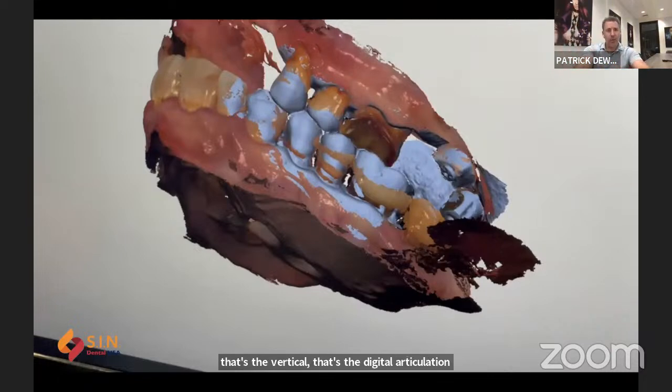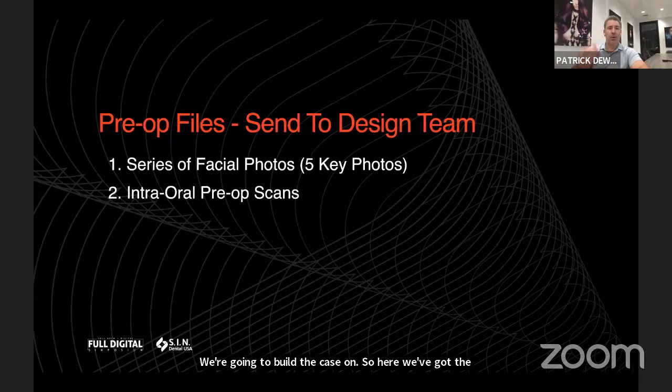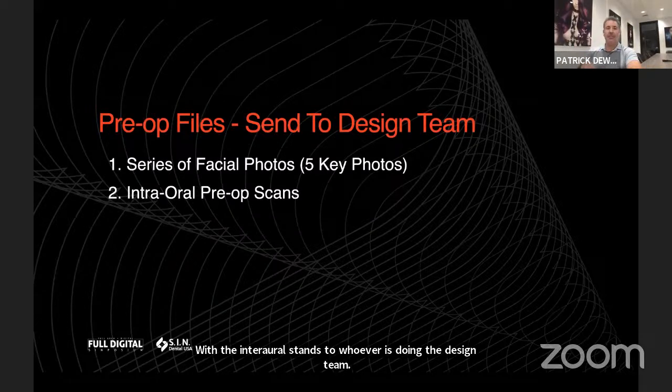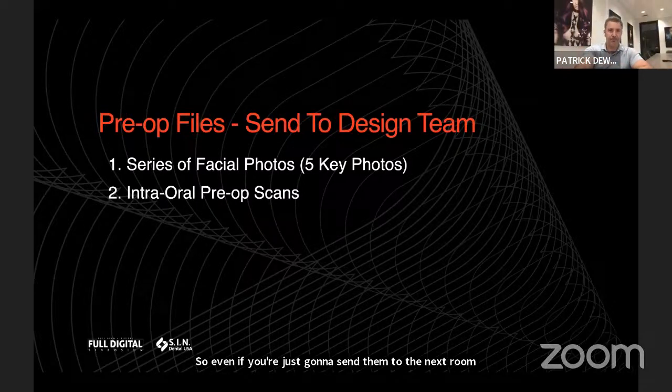So here we've got the entire upper, lower, and bite. Then we're going to send both the facial photos, the 5 key photos, or a 3D face scan with the intraoral scans to whoever's doing the design team. A lot of our customers have in-office labs where we've either trained them on exocad or they've learned exocad from somewhere else. So even if you're just going to send them to the next room or another computer, this is just organizing the files that you're going to send.